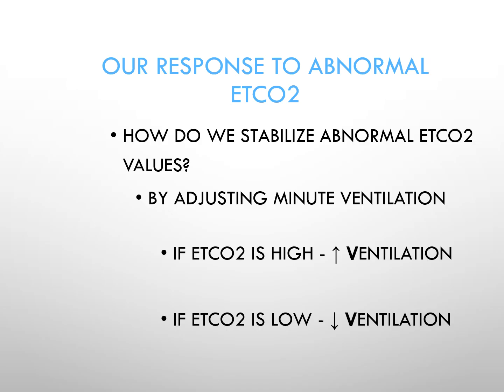If the end-tidal CO2 is high, you increase ventilation. And again, if the patient is mechanically ventilated, that can be done by increasing the respiratory rate, or increasing the tidal volume. The choice as to which you will select will often be a function of the patient's peak and plateau pressures, their driving pressures, and what their current tidal volume is in relation to the predicted body weight.